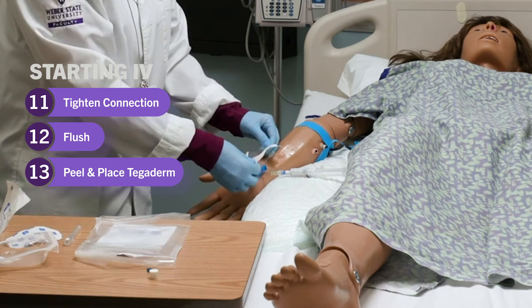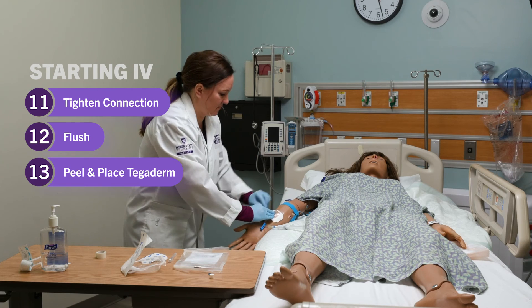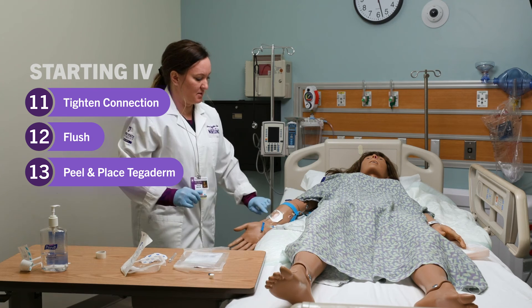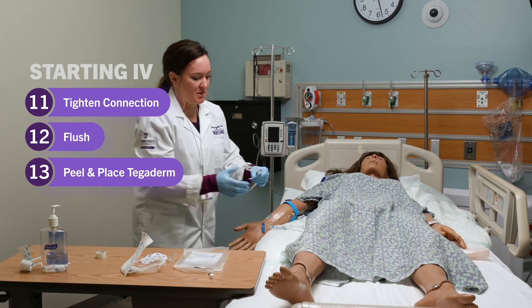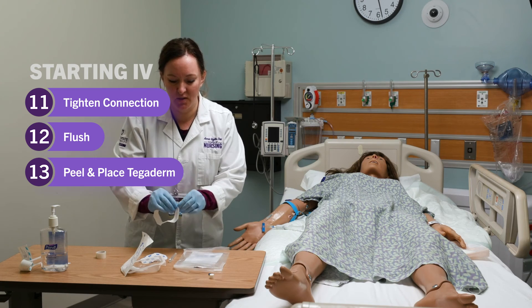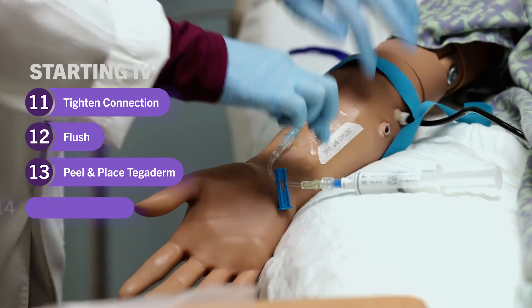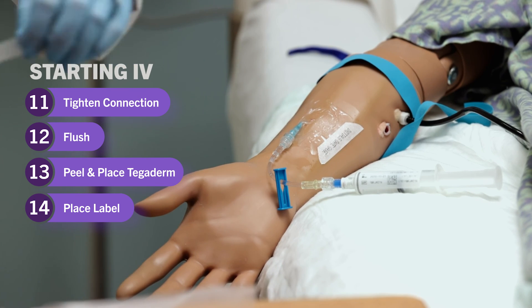Peel back the Tegaderm and place it so that your site is in view in the middle of the window. Peel off the paper part of the Tegaderm. You can write your initials, the date — it also says gauge, but you don't need to write the gauge because we all know what gauge it is by the color of the hub. Then place the label to the side, not covering the site.